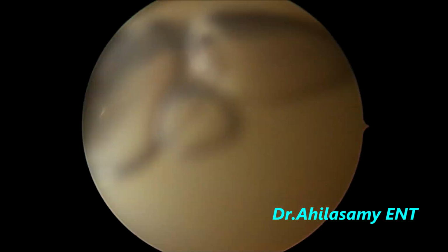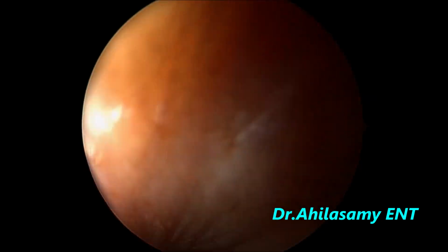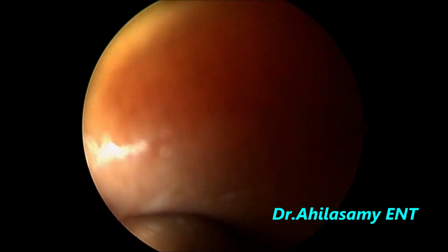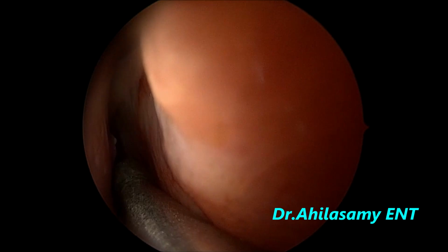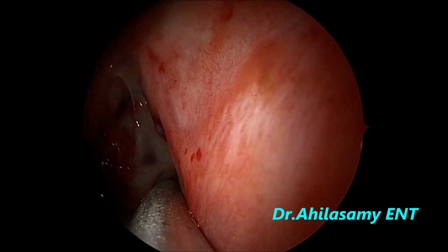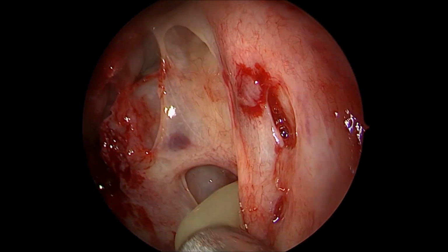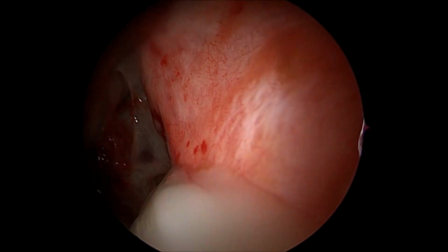All the secretions are being sucked out. Now have a good look at the middle meatus and the maxillary sinus with a 70-degree telescope, and more secretions are being sucked out.